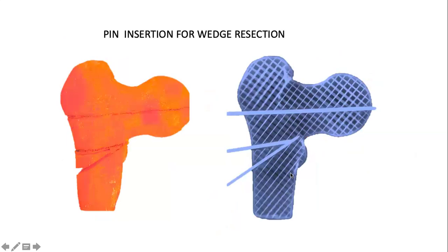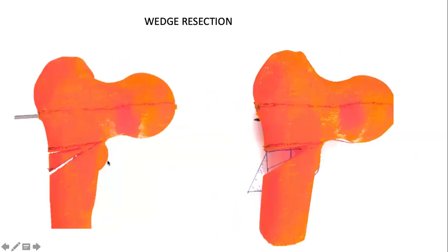So here are the wires which are coming in, the guide pin and the osteotomy wires, the two wires. And in the bone model, we've made the osteotomy. So again, we are keeping our bone model on the paper tracing which we had done and just checking out whether we are doing it in the right way.